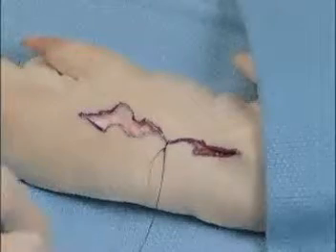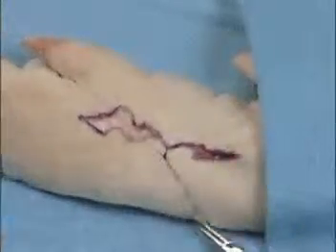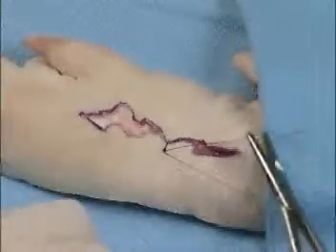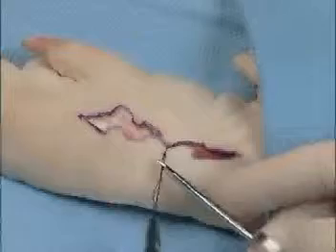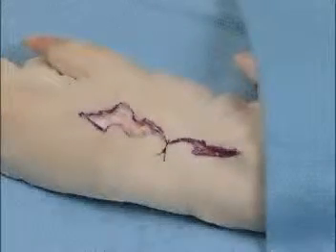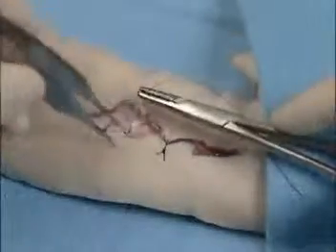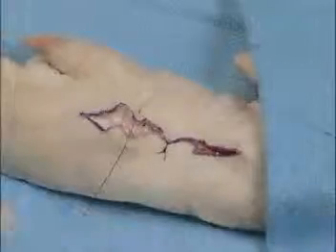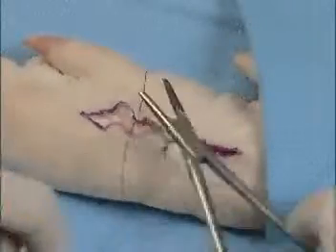And of course you want the edges to be everted. So a technique is utilized to make sure that these edges are everted. Now you can see how nicely, just with one suture placed, the wound is coming together. And that is because of the wide undermining. Again, the sutures are placed peak to valley, apex of the peak to the depth of the valley, and you can see how nicely this begins to close this pig's foot.